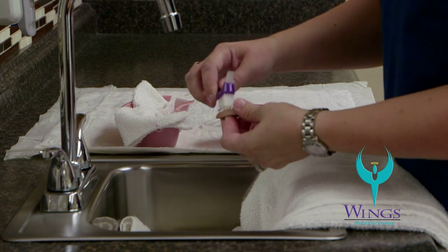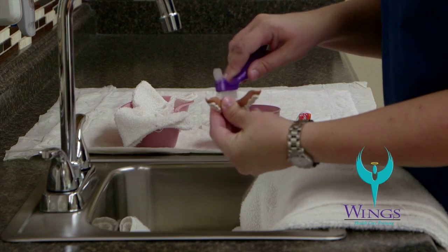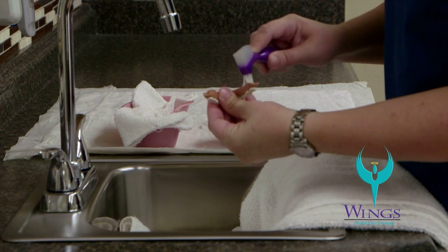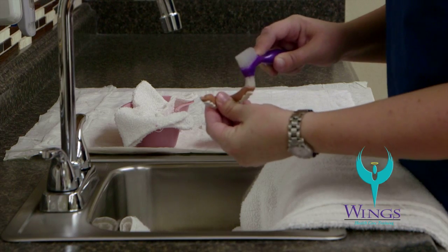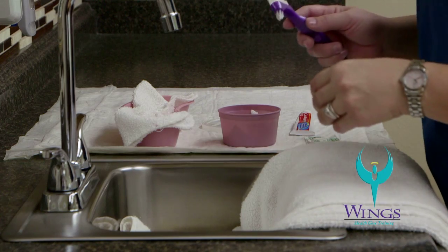Make sure to clean the chewing surfaces of the teeth, then turn the denture over to clean inside the ridge. Rinse the denture and place it teeth down in the bottom of the cup.